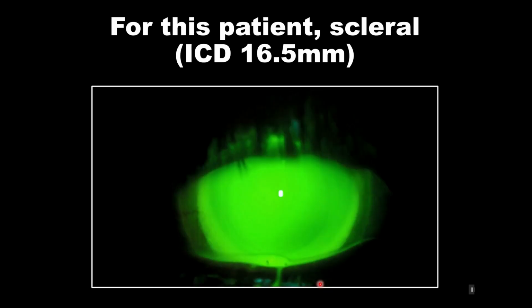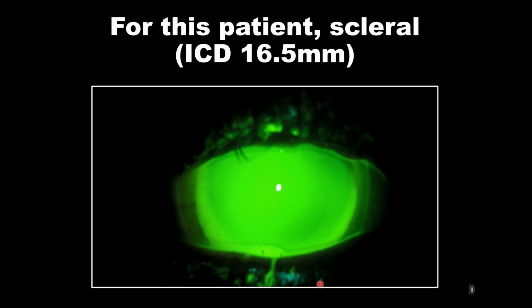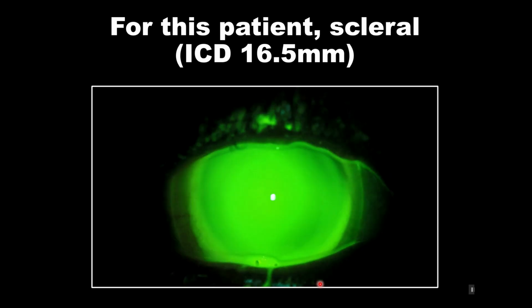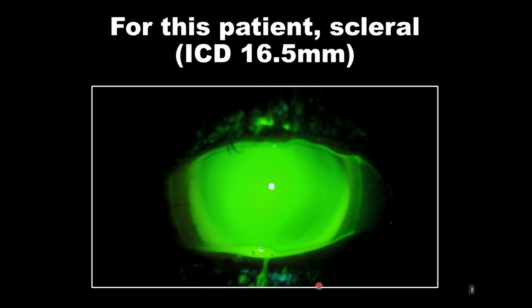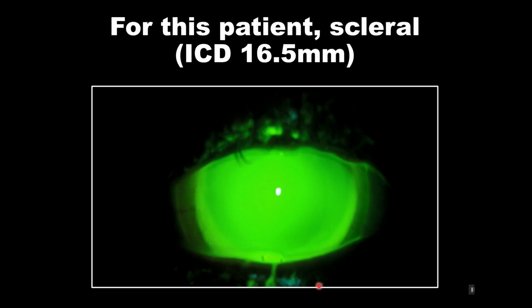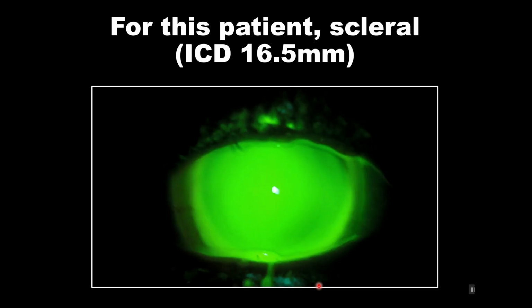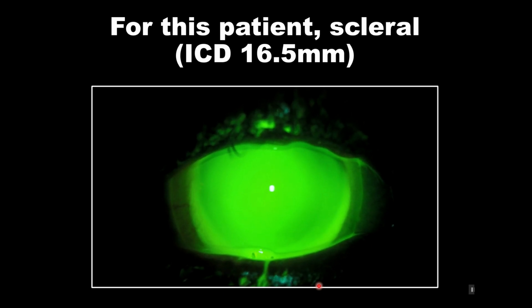So for this patient, we fit them with a scleral lens, in this case the ICD 16.5 millimeter lens. You notice how the lens vaults over top of all that irregularity, landing far out on the sclera or on the bulbar conjunctiva to create an appropriate landing on the eye surface that is more regular, that isn't diseased. And that creates a beautiful fit and outcome for this particular very challenging corneal shape.